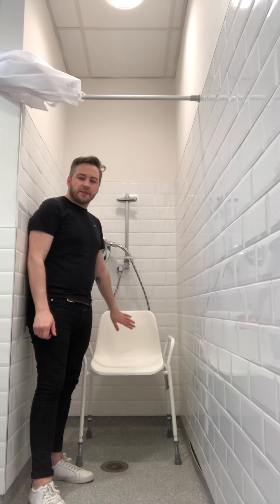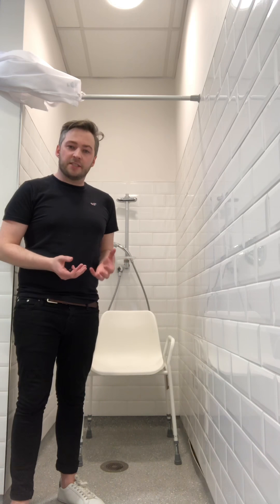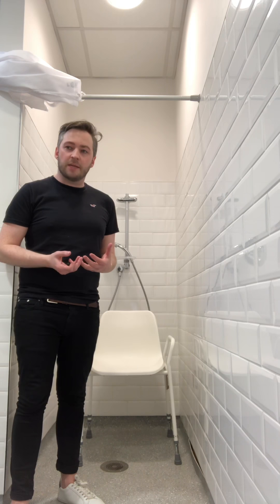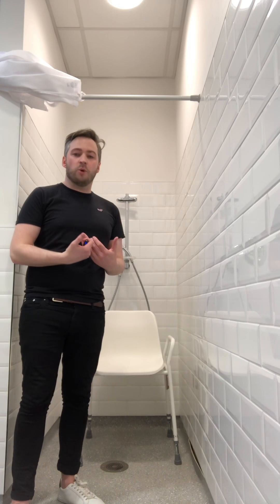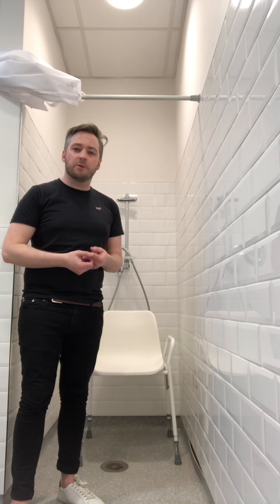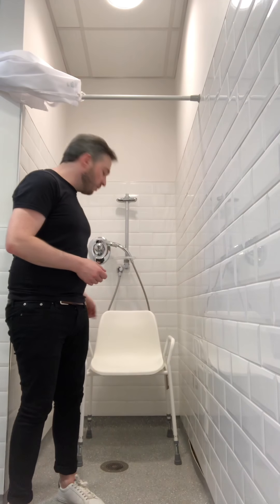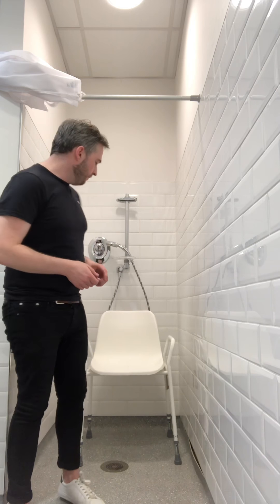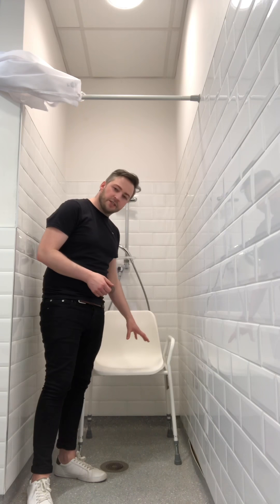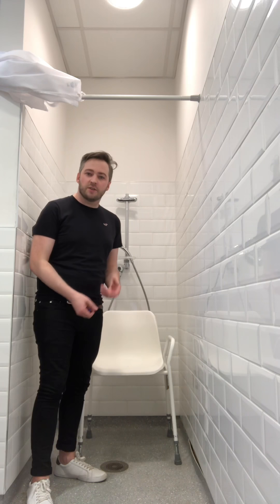Some of the benefits of having a shower chair with a backrest are for a client who might have difficulty maintaining their sitting balance. Sitting up for long periods of time can be quite hard — their energy might be low and they might need that support of the backrest to keep them sitting up straight during their time in the shower. The armrests also help with the sit-to-stand by giving you something to push up and down from.